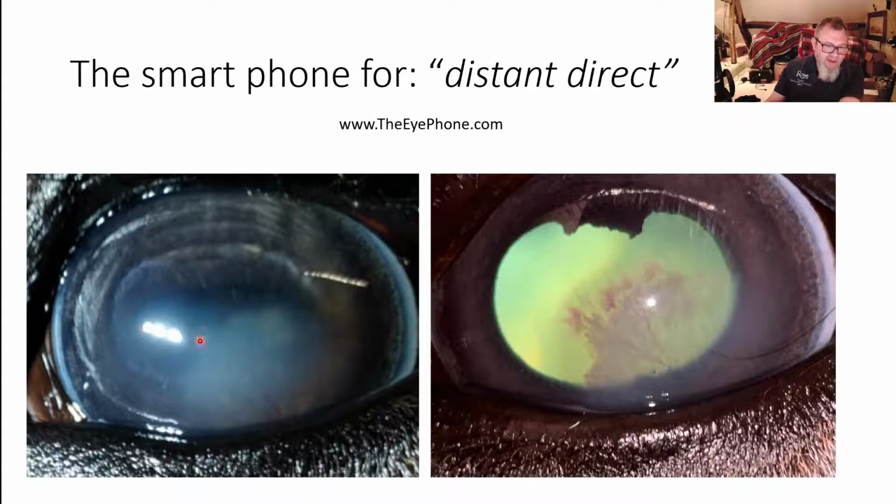So yes, it's got lovely corneal reflections. We can see there's some corneal opacity, some grey areas and some red areas. When we turn the light on, these corneal reflections disappear. We retain some of the corneal reflections from the upper eyelashes, but now we can see these blood vessels highlighted against the fundic reflection.